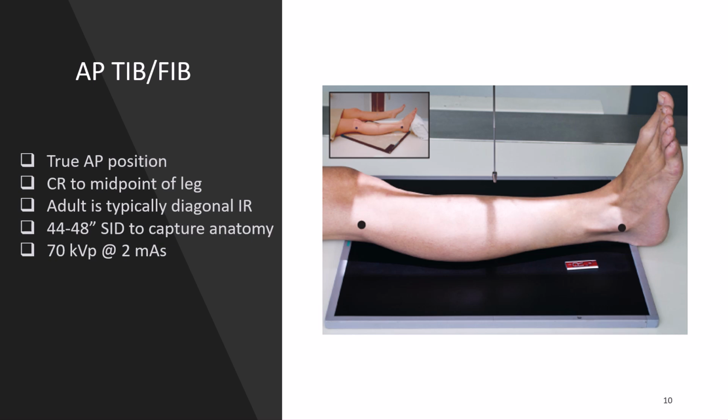But on follow-up imaging, like if you were following up with an orthopedic after diagnosis of a fracture or something along those lines, then at times it is possible that you only include the joint closest to the site of injury. But on initial imaging, you always need the joints at both ends of the long bone.